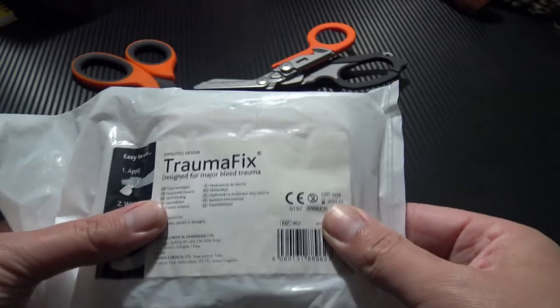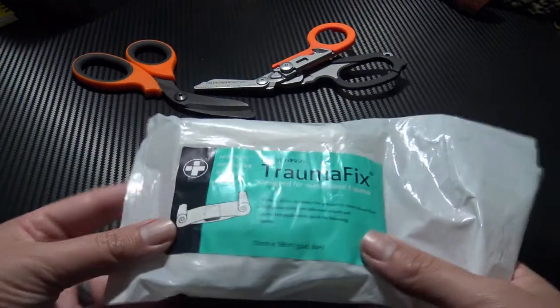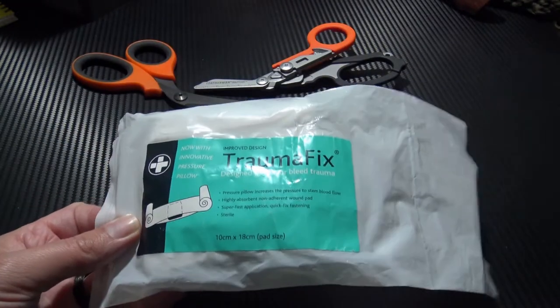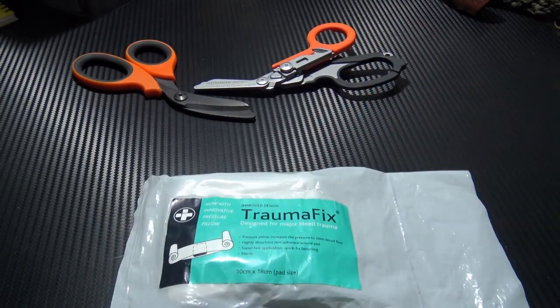These have a nice long shelf life. This one is 2024, so that's perfect. And here you can see the Trauma Fix logo.